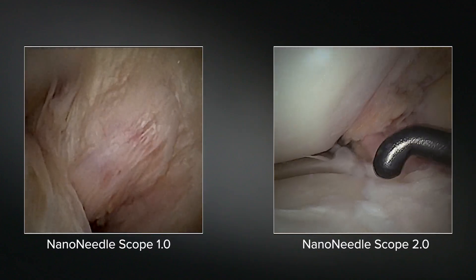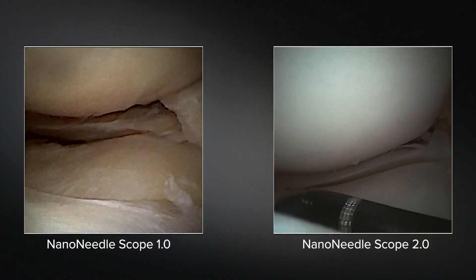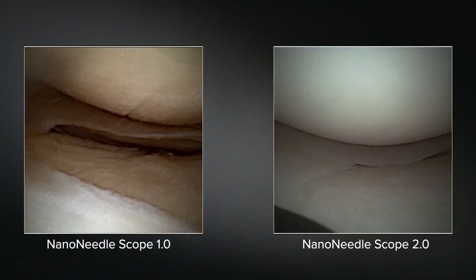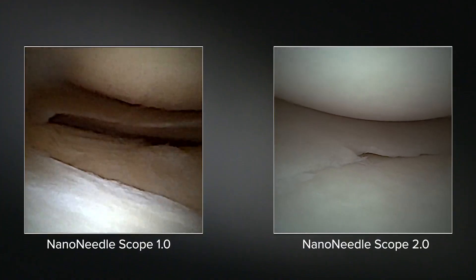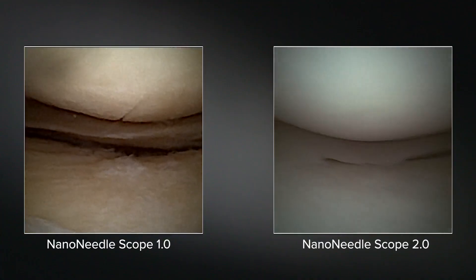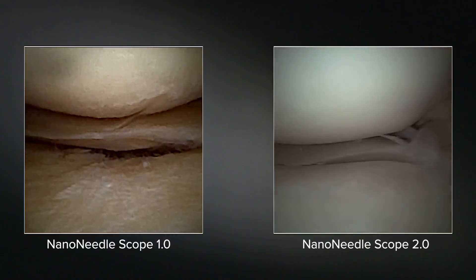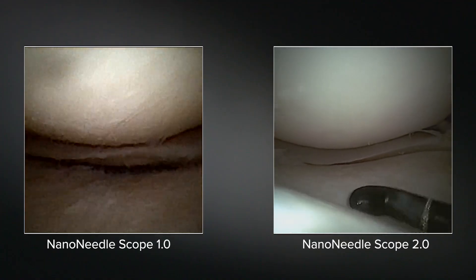Starting off going to our lateral compartment — as you can see, the knee is literally just hanging out in flexion; we're not manipulating it at all. I can see pretty much the entire lateral compartment with the Nano Needle 2.0. I'm looking closely at that tiny little radial tear there. You can see the fraying in very high definition, the color differentiation between tissue planes, and the cartilage really beautifully. And that was all done without having to do any figure four or anything.